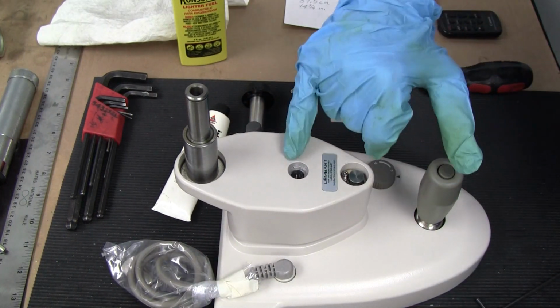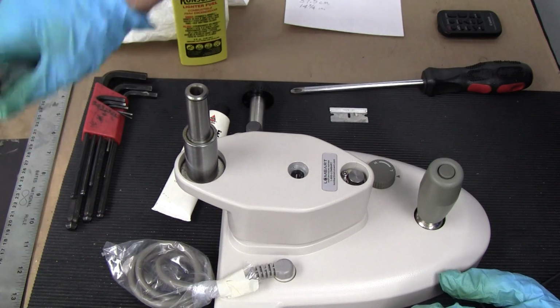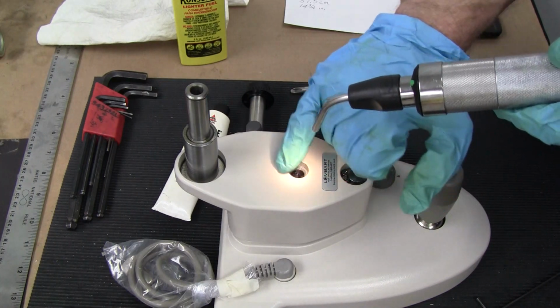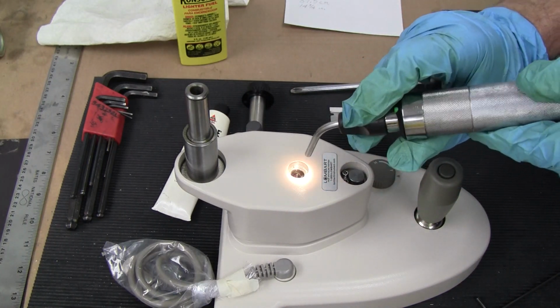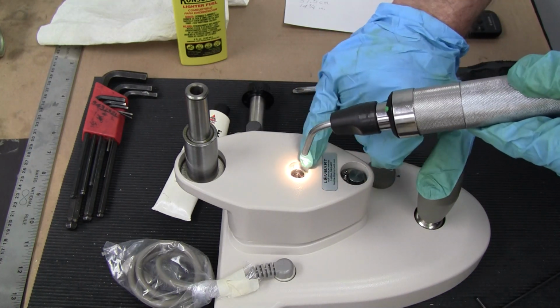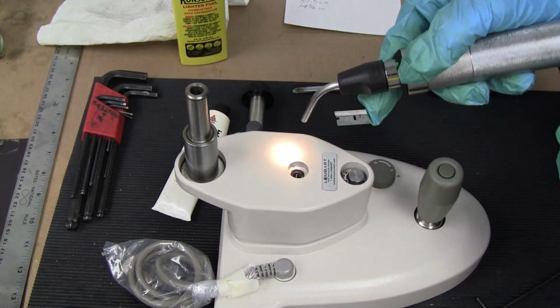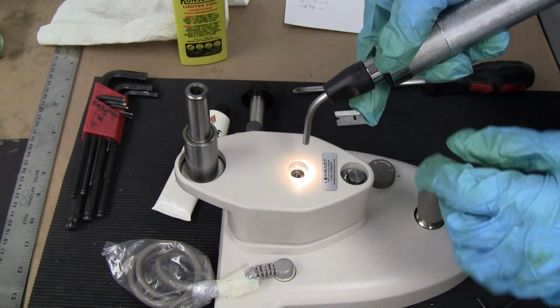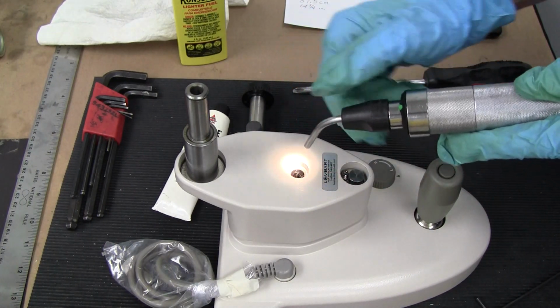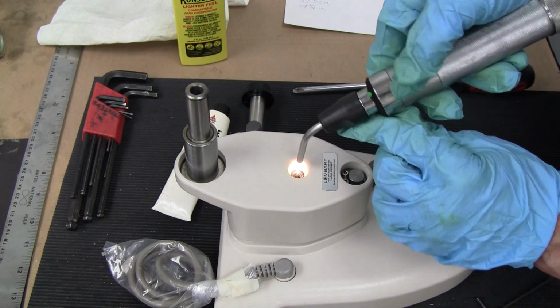That's usually an issue. Now, while this is all down, you want to observe how well the shaft on your bearing assembly is seating inside here. You want to see what it looks like. It's not going to be flush. It's just going to be a little bit lower than flush. And so when we put everything back together, it's important that you recognize what that looks like.